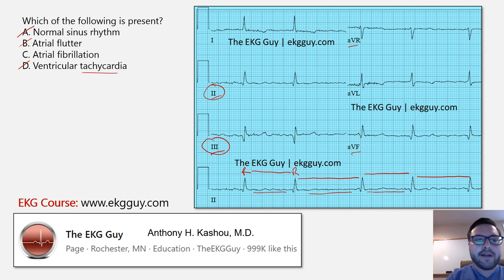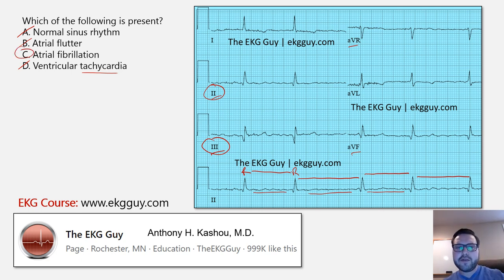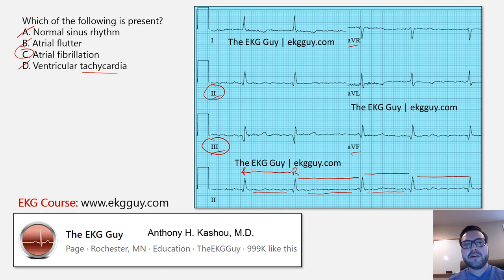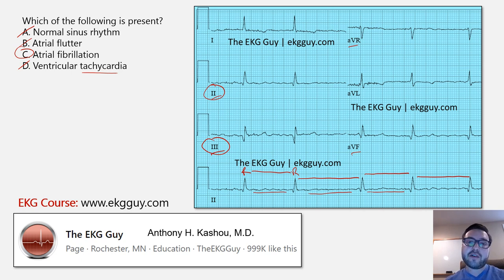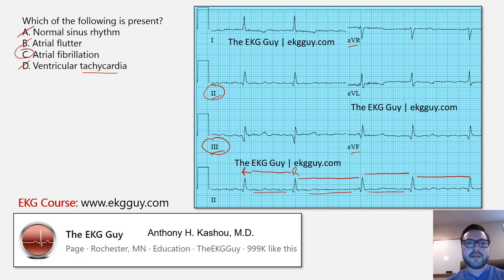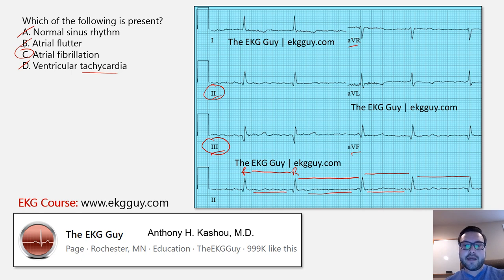The correct answer is atrial fibrillation. Hopefully you got that. It's one you certainly don't want to miss, because atrial fibrillation changes our management and how we treat patients — whether it's rate or rhythm control — and it has prognostic implications for the therapies patients should be on. This rhythm is atrial fibrillation, given the irregularly irregular nature of it and the absence of clearly defined P waves.